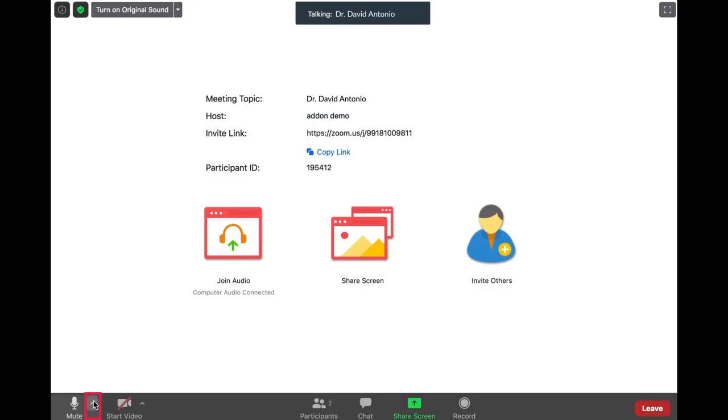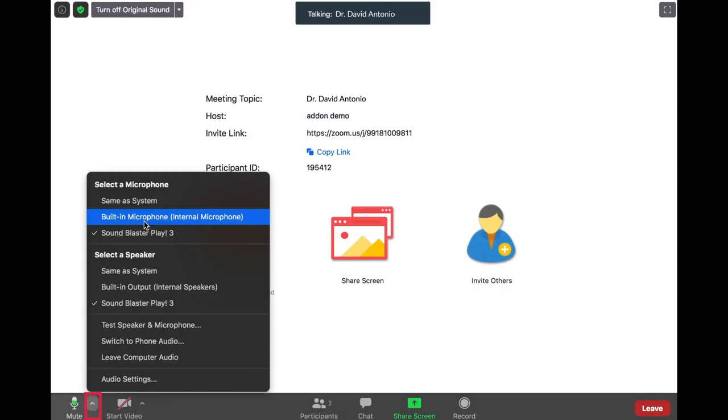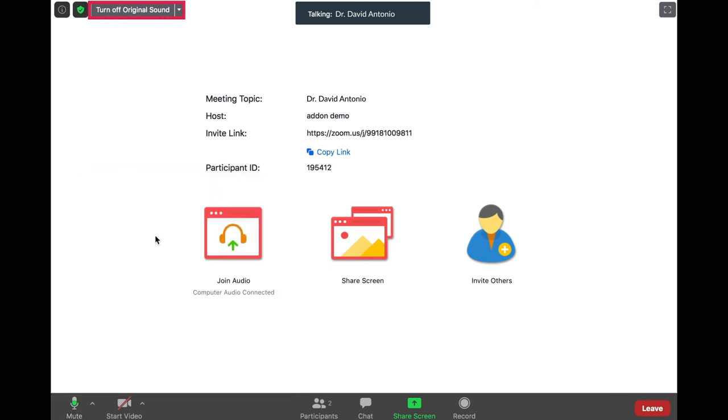When you are finished, click on the arrow next to mute once again and select the built-in microphone. Turn off original sounds and resume talking to your provider.